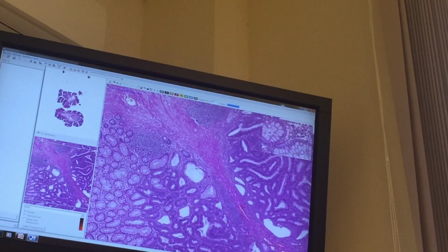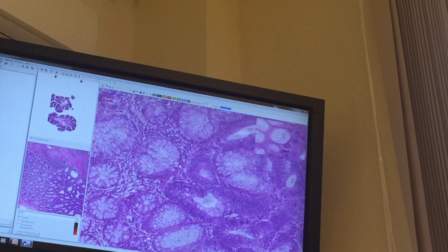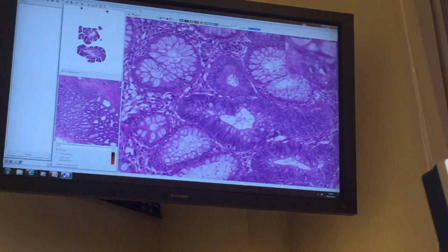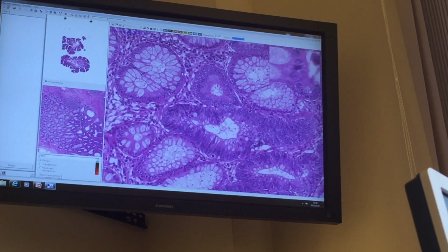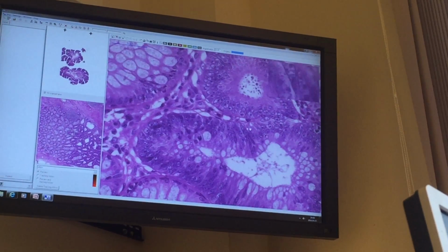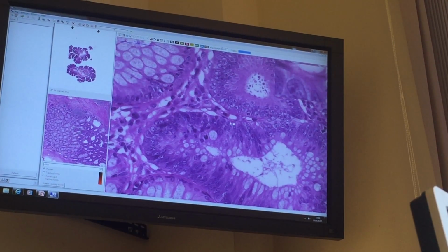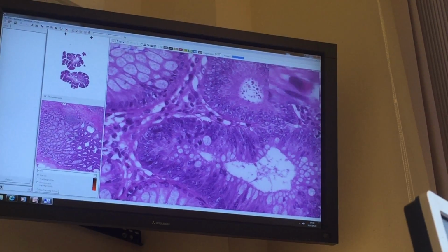And even this is a good part, and if you compare the 2 types, you can see this is one line of epithelium. The nuclei are at the basal part of the epithelial cells. Right next to it, this is the dysplastic gland. You can see this pseudostratified epithelium, so more cells and more lines.